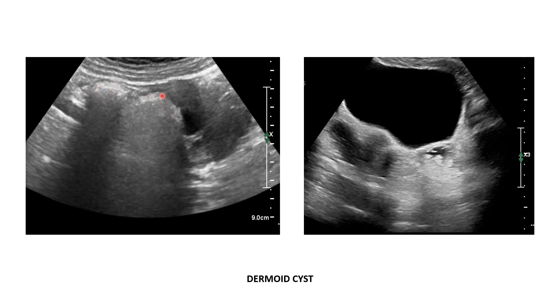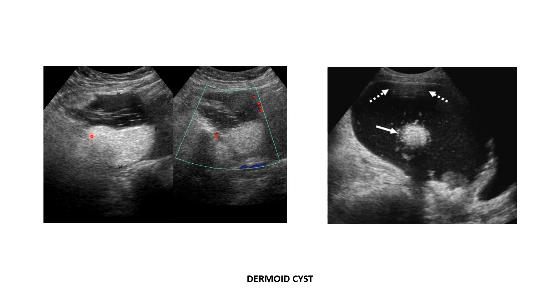There are two areas of bright components with shadowing in this patient, and this is typically fat echogenicity inside the left ovary. Large areas of bright echogenicities with linear echogenicities inside the cystic component. This is an old but good example with floating fat inside the cyst — this is not a reverberation artifact. This is fat floating in the upper part of the cyst. There are also some other components.